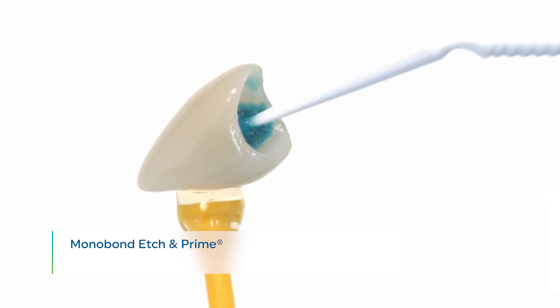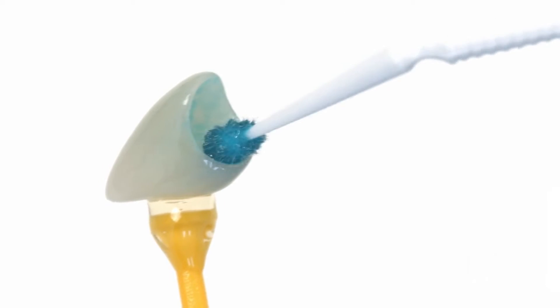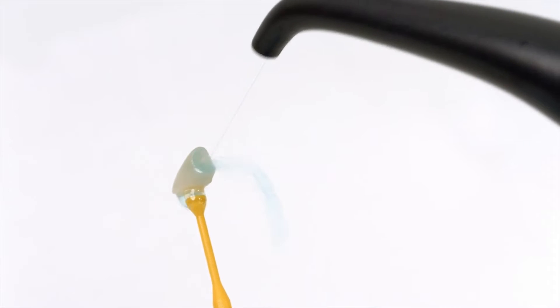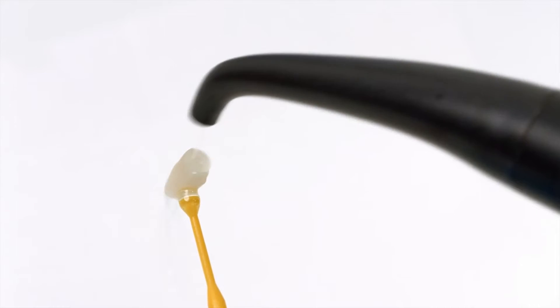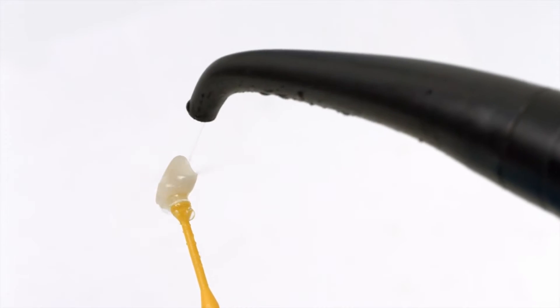Apply Monobond Etch-In Prime bonding agent to the bonding surface with a micro-brush and rub it onto the surface for 20 seconds. Allow it to react for 40 seconds. Rinse off Monobond Etch-In Prime with water and thoroughly dry the restoration for 10 seconds with a strong stream of air.